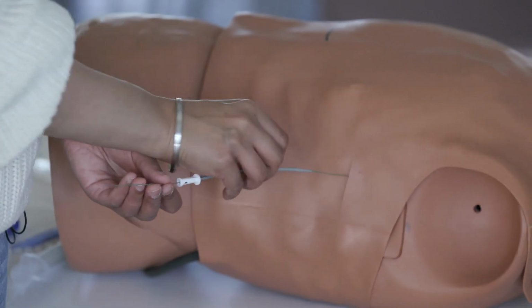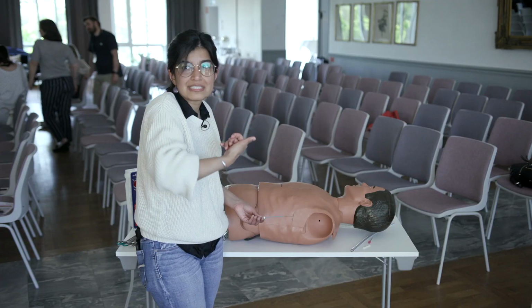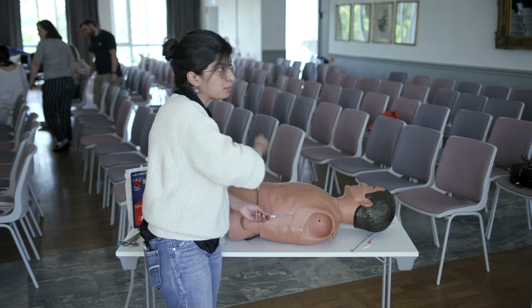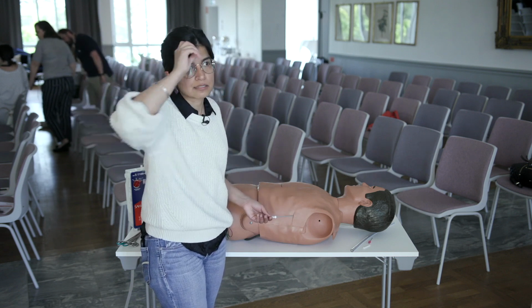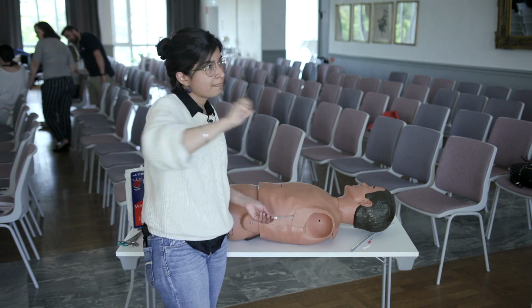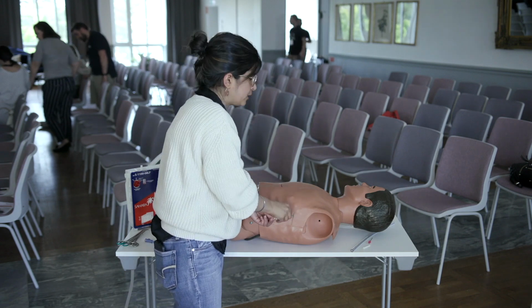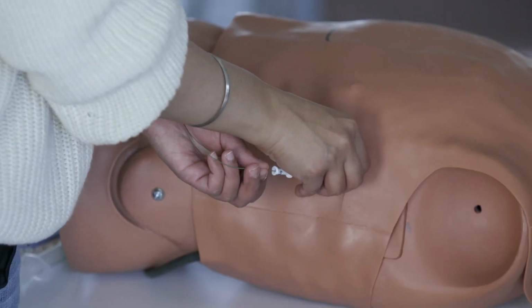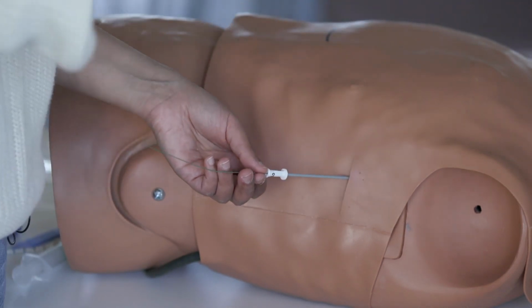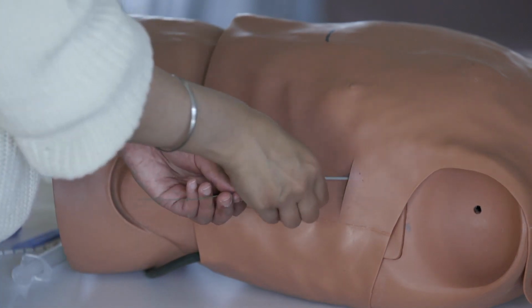Corkscrew in, corkscrew out, corkscrew in, corkscrew out. When you're coming out, you're physically ripping the fascial planes on your way out. So you'll notice when you pull out, there's a little skin tent that comes with you, right? That's perfect. That's what you want. You want to tear that fascia. And then the more you go in and out, the smoother it becomes, right? You want to introduce it to a point where you feel the pop of the pleura, and you always will feel the pop of the pleura. And once you do, it'll become smoother on your way out, okay?